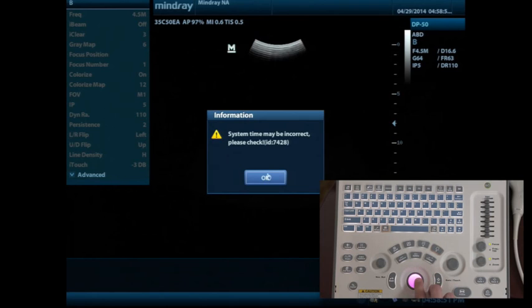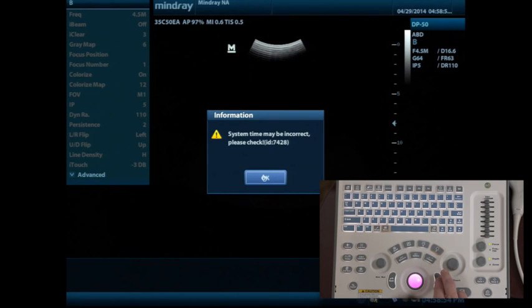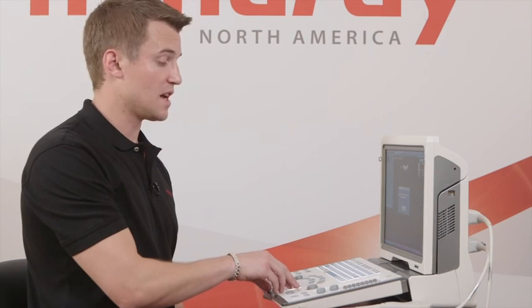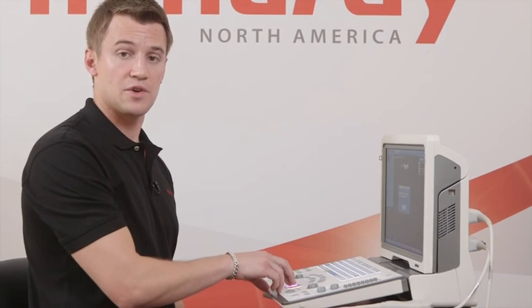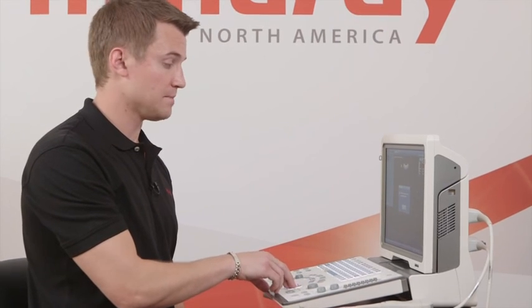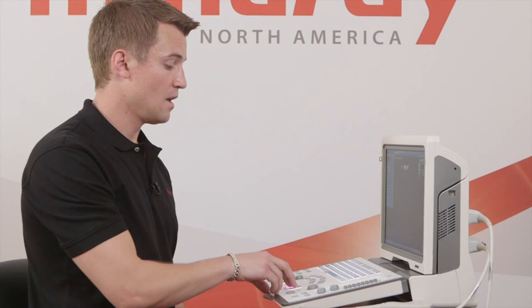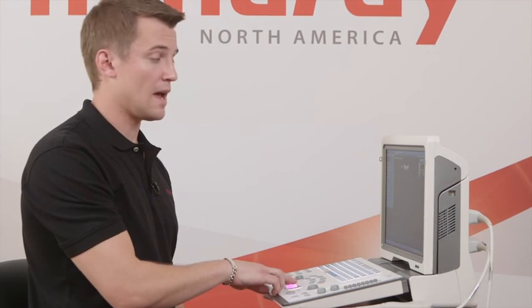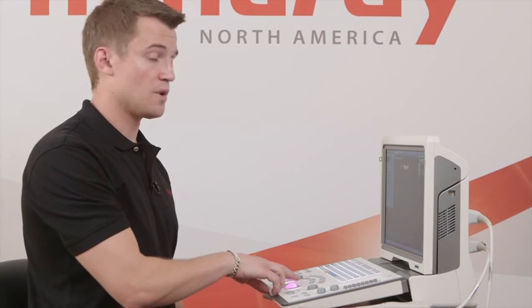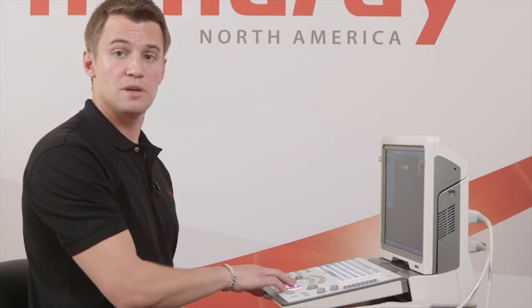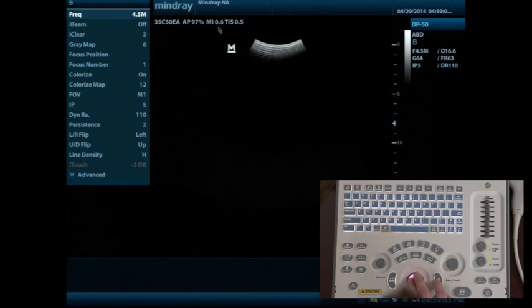As we adjust the date and time, the first time we reboot, it will say that the system time may be incorrect, and we'll discuss how to set the correct time and date. Once we click OK, we'll see that we're in our normal imaging B-mode screen.